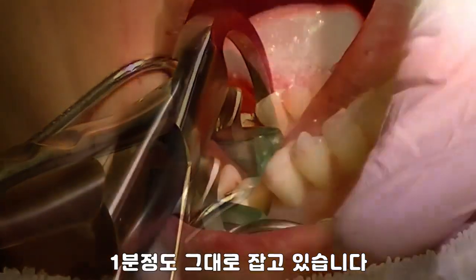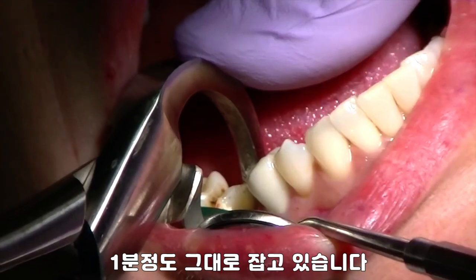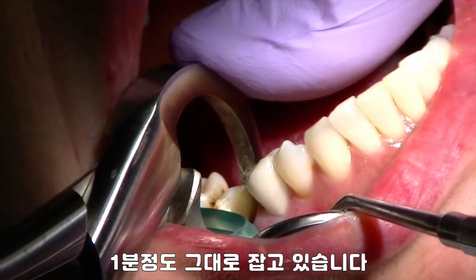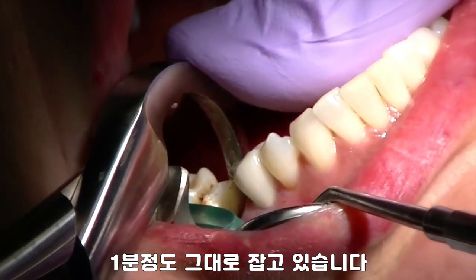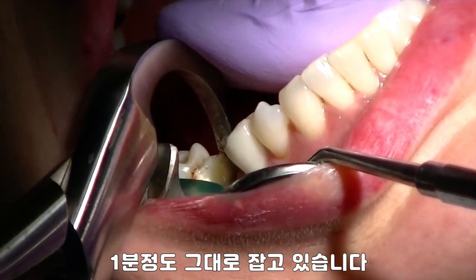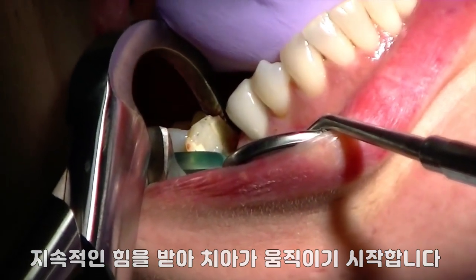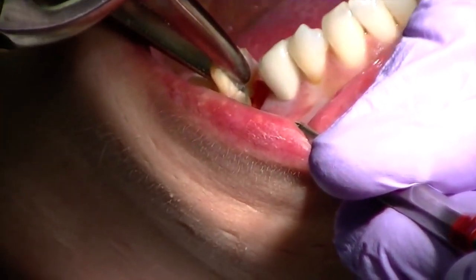You can see I was barely holding it — I'm rotating my wrist towards the shoulder, and in a minute or so the tooth will start to disengage and come up and out of the socket. We want to make sure we have stability, and the root structure will start to come up and out. The instrument is not intended to remove the tooth in total; rather, it's intended to luxate it one to three millimeters.